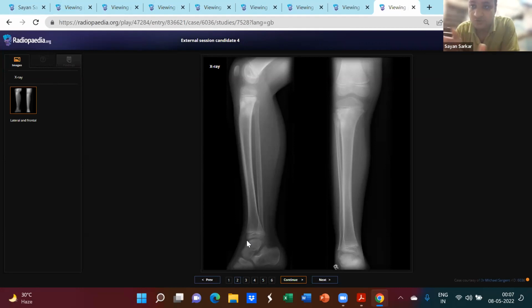I am not asking what calcification is associated with. I am saying in your descriptive terminology, you're describing calcification as a part of which property of the lesion? So whether it is a bone forming lesion, yes, you're trying to see the matrix, right?